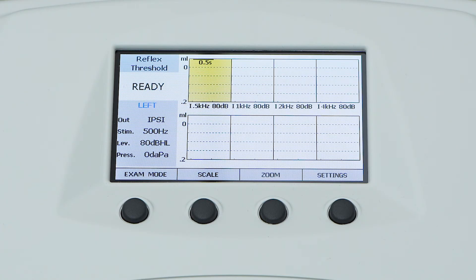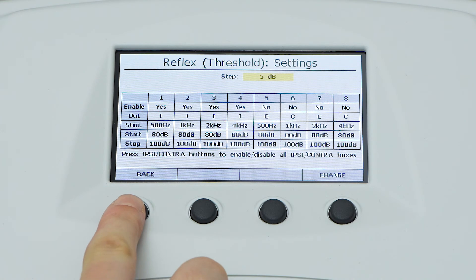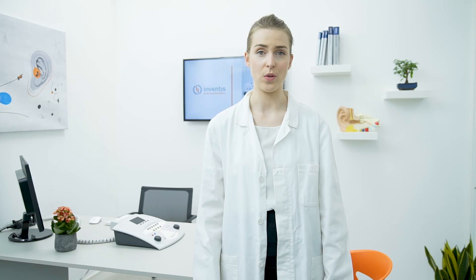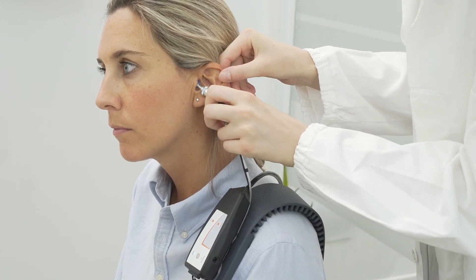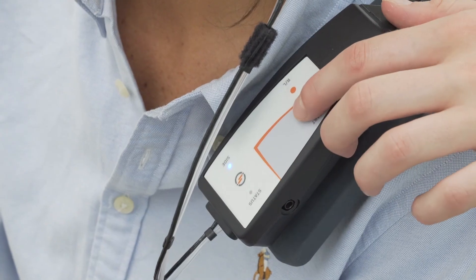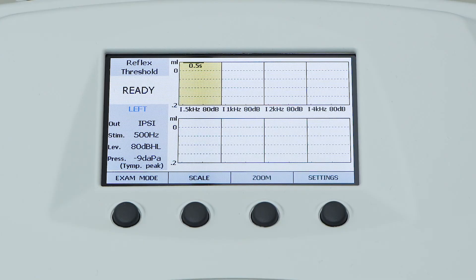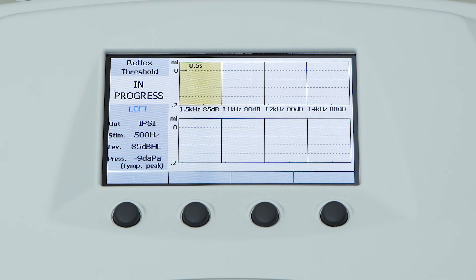From the reflex test screen, by pressing the function button settings, the operator can access a window with all the editable parameters for the selected test method. After having set all the parameters, introduce the probe into the patient's ear canal and start the exam by simply pressing the start button on the keyboard or on the control box. Up to eight different stimuli will be tested.